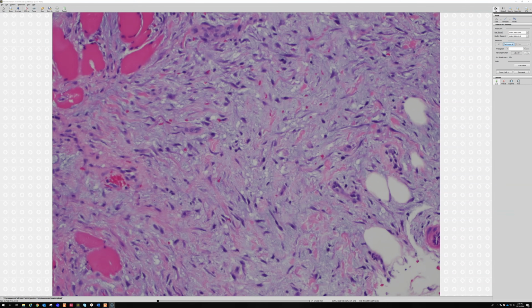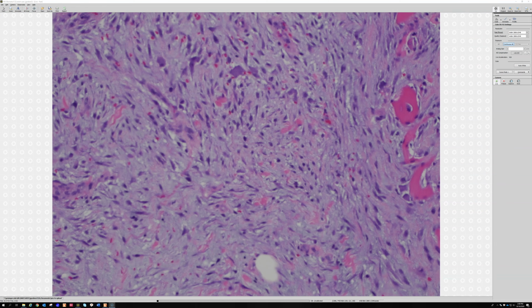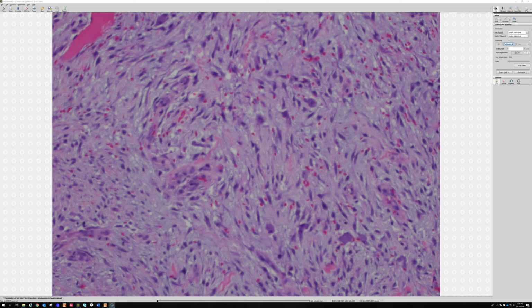What about these cells here? What do these cells kind of look like? This area, this kind of loose, a bit hypocellular, kind of spindly to stellate cells. If you ignore those big, huge cells floating around in here, I think this background looks kind of myxoid. I think it kind of looks like nodular fasciitis a little bit. There's extravasated red cells.